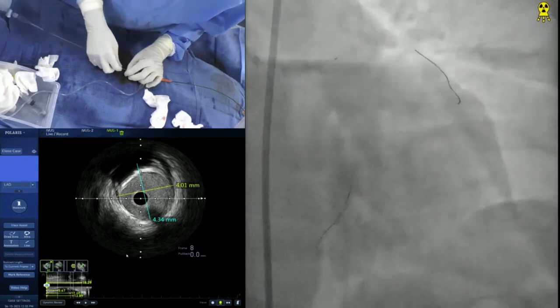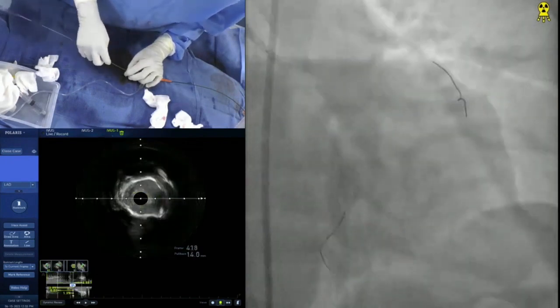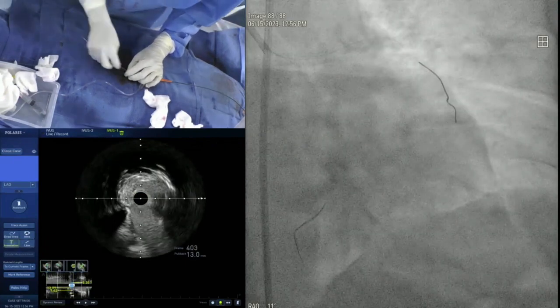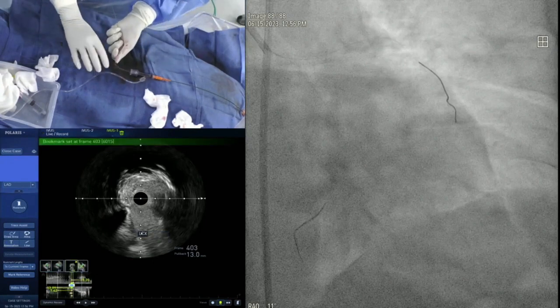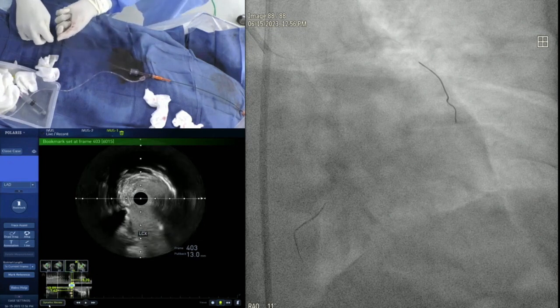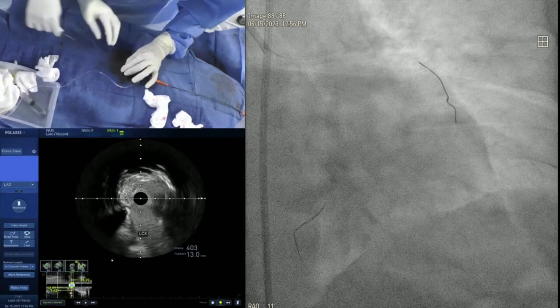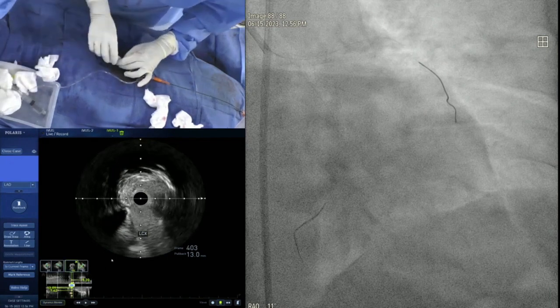Yep. And I think imaging is reassuring, particularly for operators that are not as facile and who don't do a lot of these, to reassure yourself there isn't much there that you really need to worry about. I think 4.5, 8. Take a picture. And then, okay, take a picture. We'll do a quick 4.5, 8, and then we will IVUS. So everybody is happy with it. Ready? Yeah.